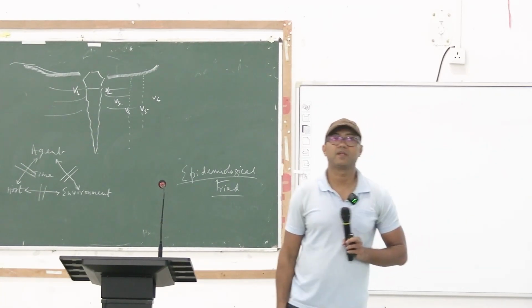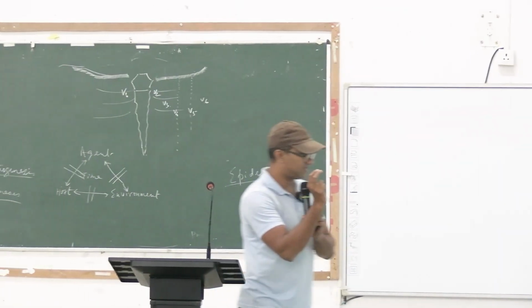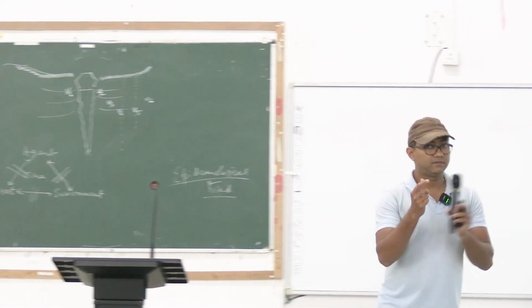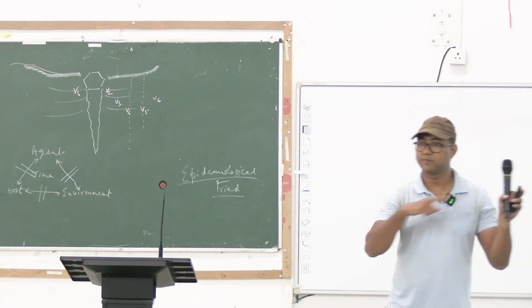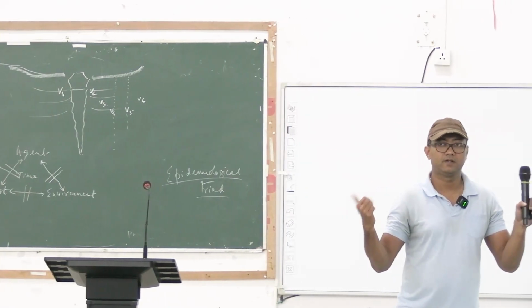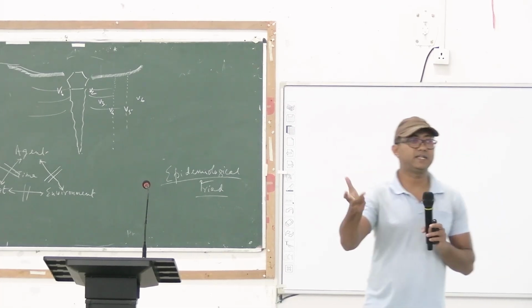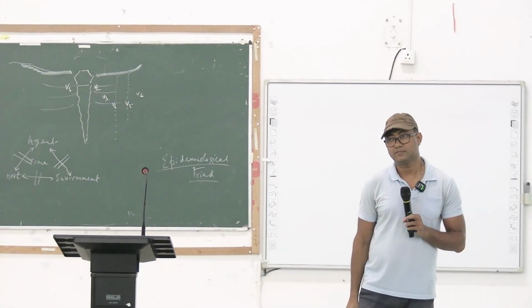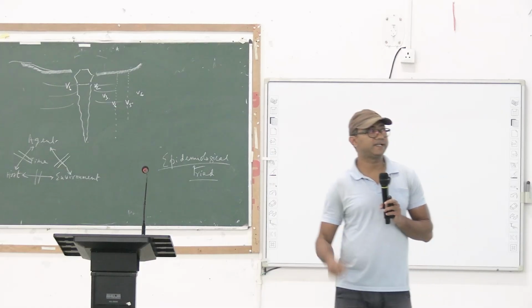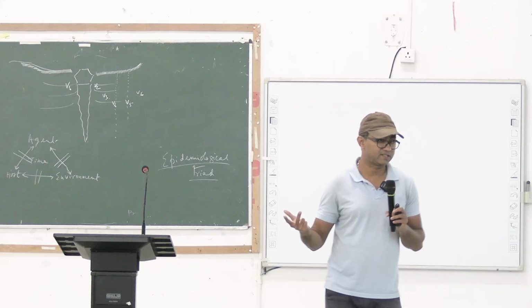Now tell me, I am putting the right clip on my right side, the red clip on the right side and the yellow clip on the left side. The potential difference between red and yellow is your lead 1. So, essentially a lead is measuring potential difference between 2 points. Now, what about V1? V1 is a chest lead. V1 is supposed to measure potential difference between which 2 points? My question is as simple as that.